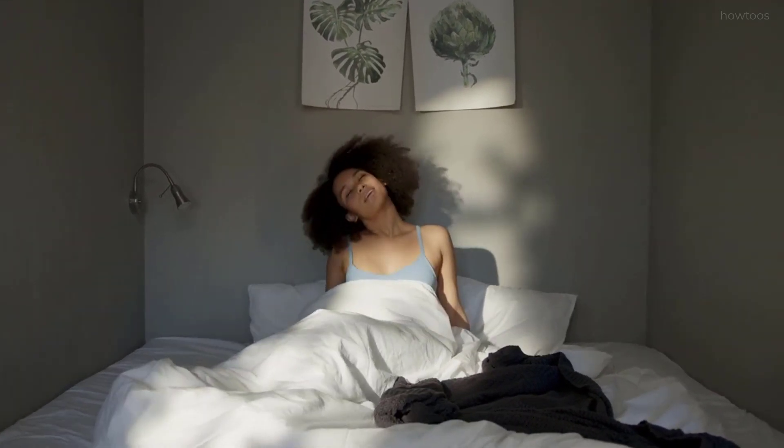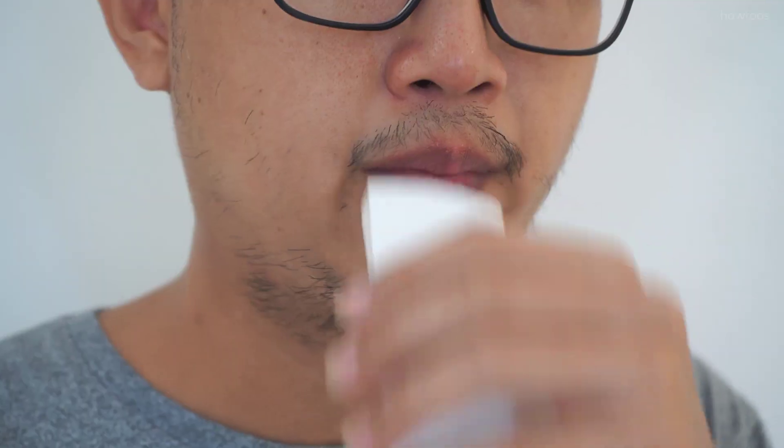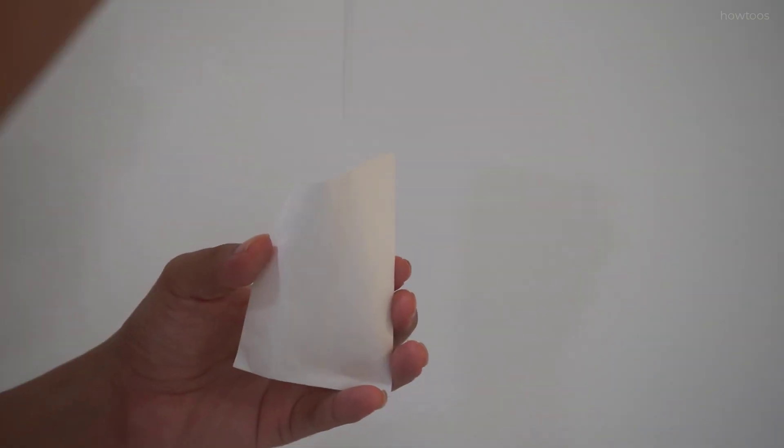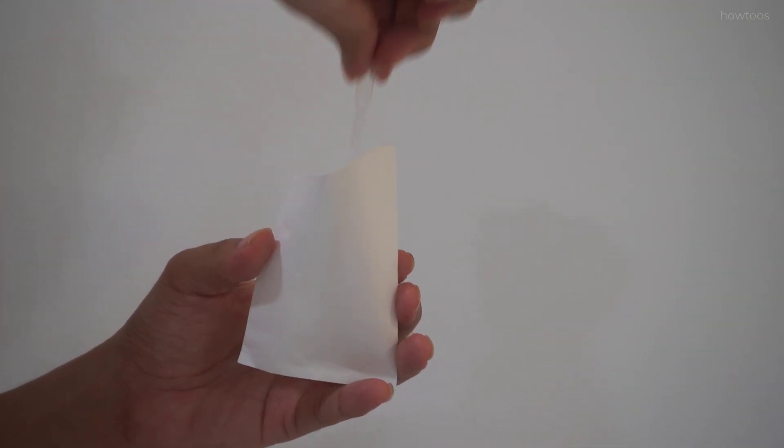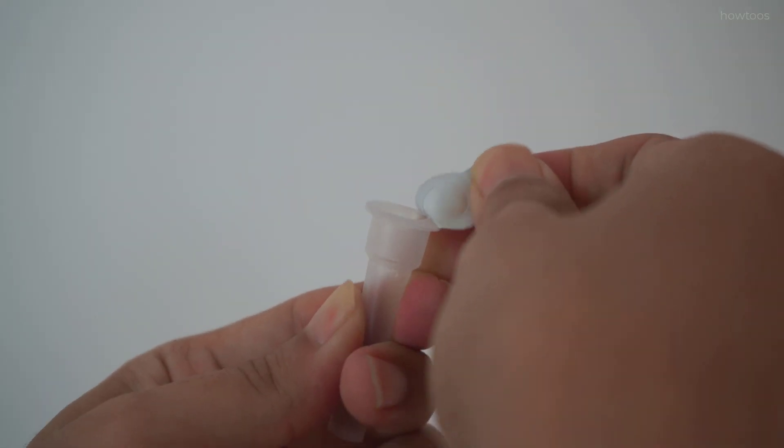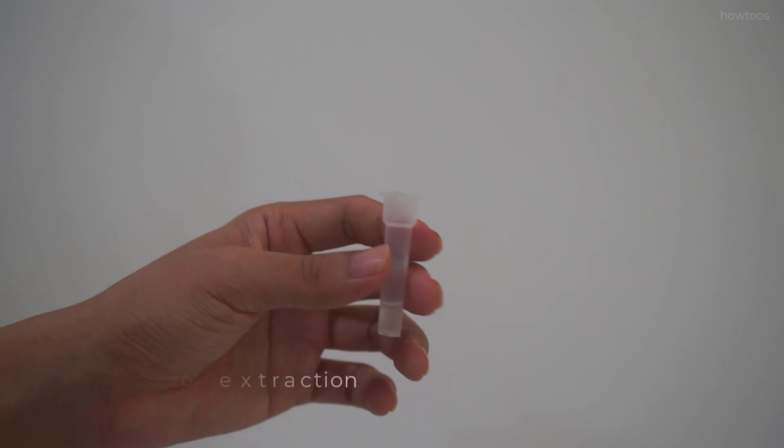Take a deep breath. Expectorate deep cough sputum into the paper cup container. Use the sputum dropper to transfer around three drops of sample into the sample extraction tube. Open up a new sample extraction tube. Drop three drops of sample into the extraction tube.